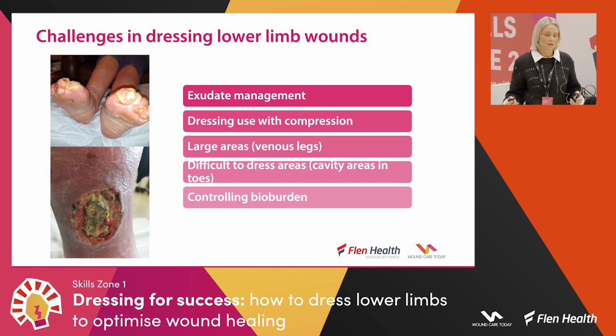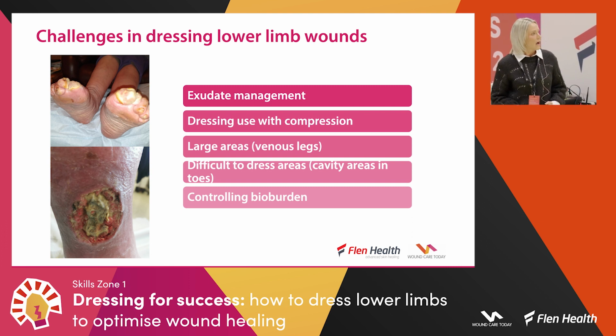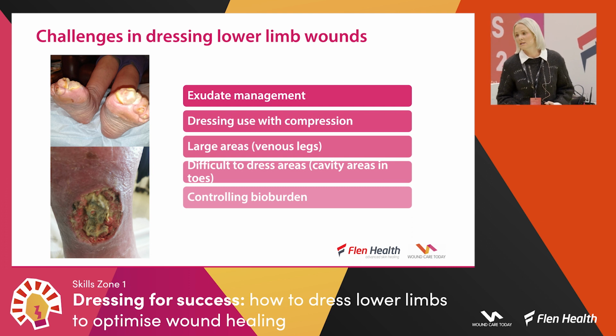NHSI says, NICE guidelines say that we need leg compression, but can it actually go in compression with maybe your primary dressing? How do I dress these leg ulcers if they're not in compression? Difficult to dress areas, cavity wounds, maybe you've got wounds in between the toes, a fungal infection. How are you going to dress those? And we'll be demonstrating. And then also controlling bioburden and infection.